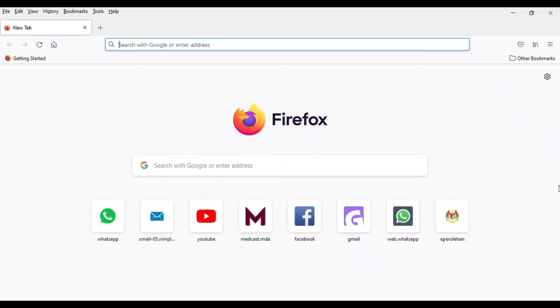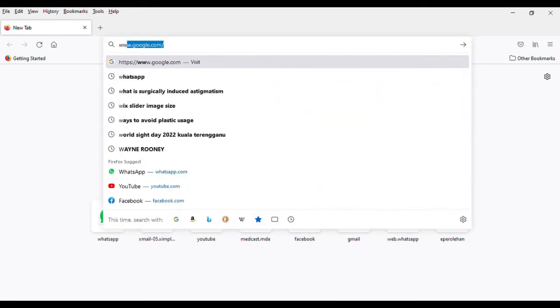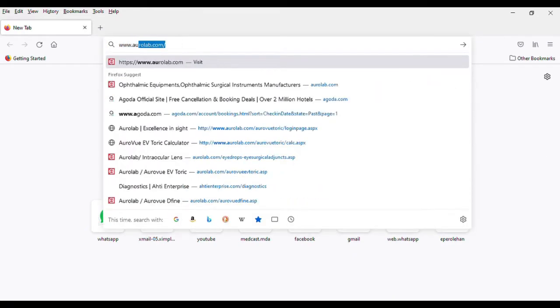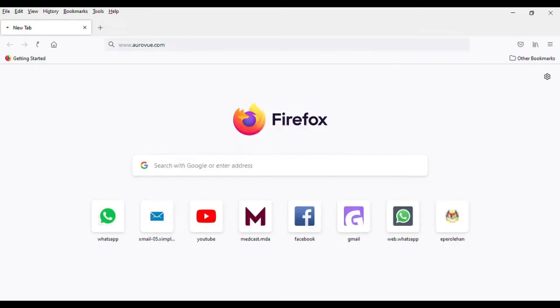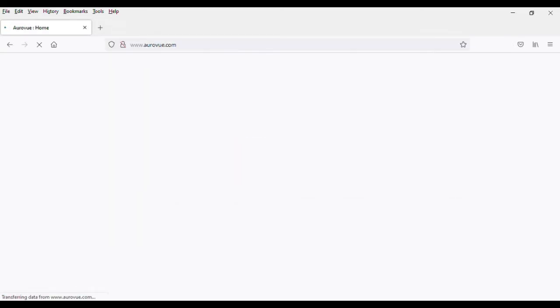To get started with the TORIC calculator, here are the easy steps to be taken. On your web browser, go to www.aurovue.com.